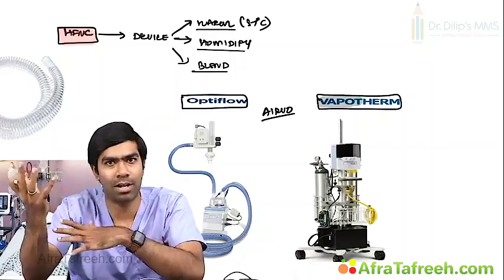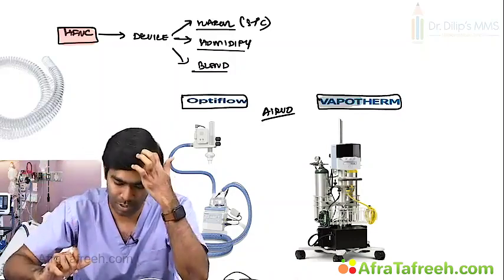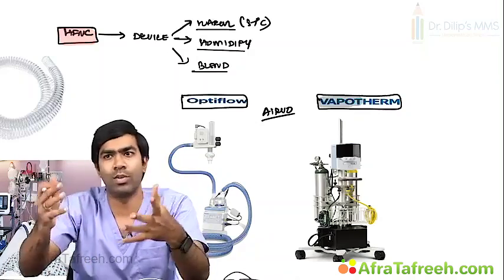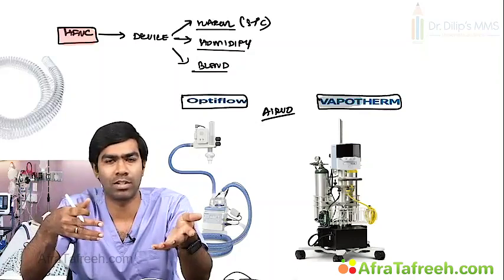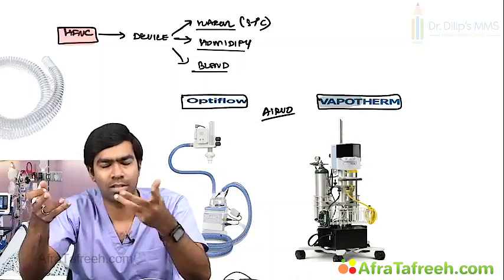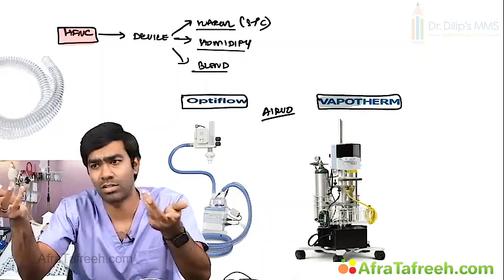It's like making a sambar or a rasam, isn't it? You mix everything in appropriate proportions and deliver to the particular customer. Clear? So this is what this blender does. You can deliver, for example, 60 liters at 100% oxygen FiO2. Yes, this can do that. 40 liters at 80%, can do that. 60 liters at 60%, yes, this can do that.